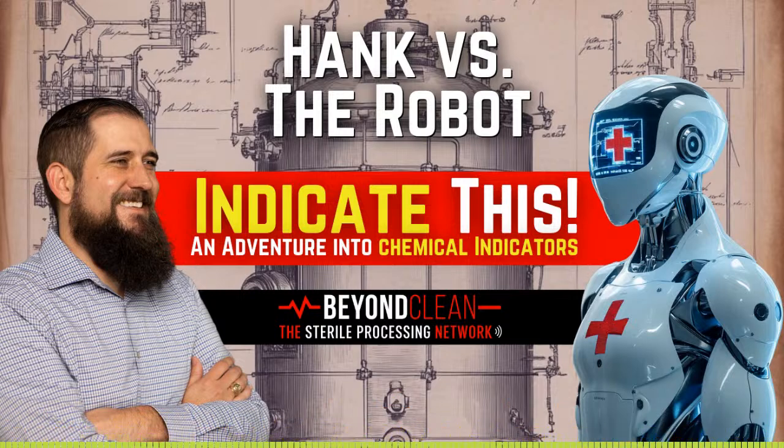One little nuance to your comments there about biologicals. In the past, they've been 24 to 48 hours. Now they've brought it down all the way to 4 hours to 1 hour. We've got some that are just a few minutes now to get that biological readout. So I just want to make sure the audience is aware of that and that you're aware of that. Maybe for future interviews, I've taught you a thing or two on today's interview, Simon.